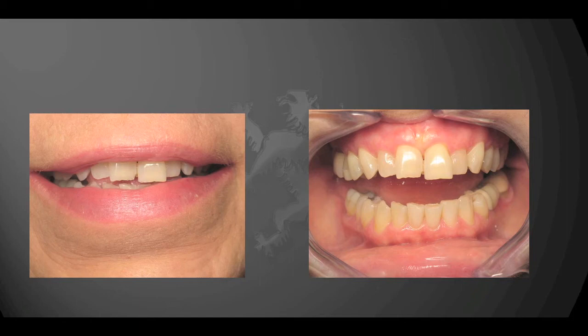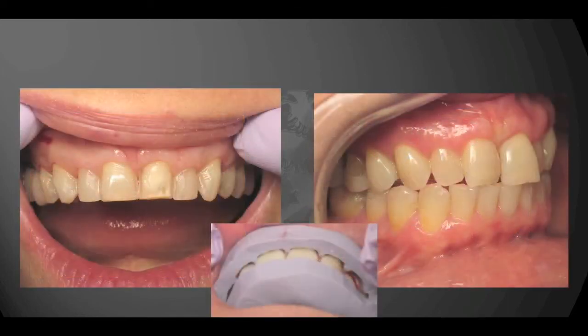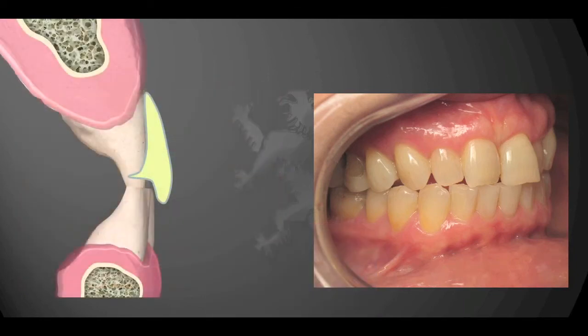Can we do it a different way? Yes. This case is a patient who has a similar border-to-border situation, and some areas even a slight cross bite — she has destroyed and damaged her teeth because of that. She did not want to have orthodontics or pay for ortho first and then veneers. The good news is her lower anterior teeth were fairly straight, so it's not so much of a problem. We decided to do a minimally invasive preparation approach. The amount of tooth removed was very, very little, and the approach is essentially a 1mm reduction on the incisal edge.